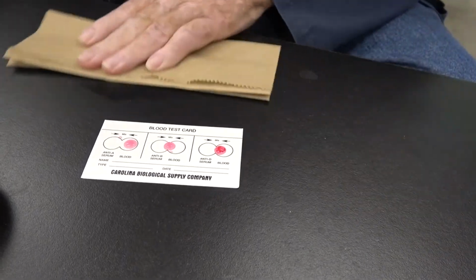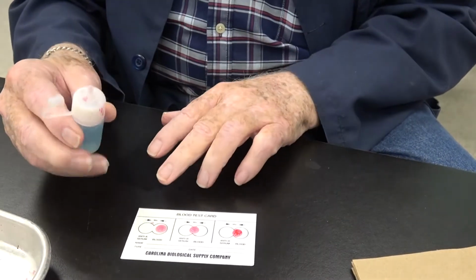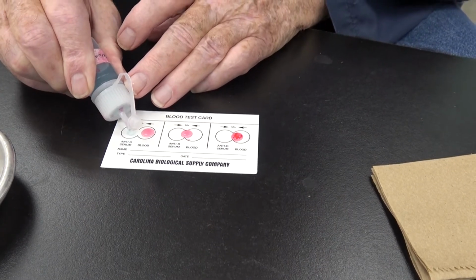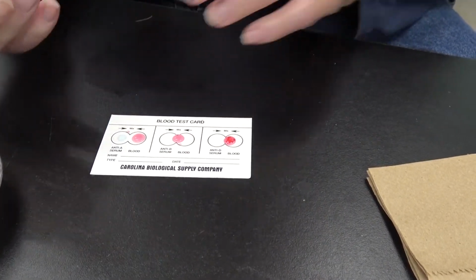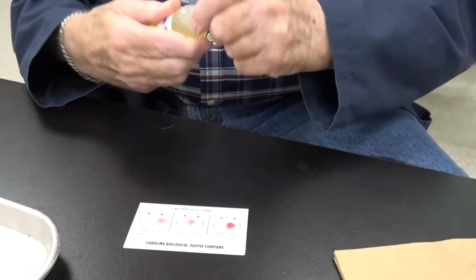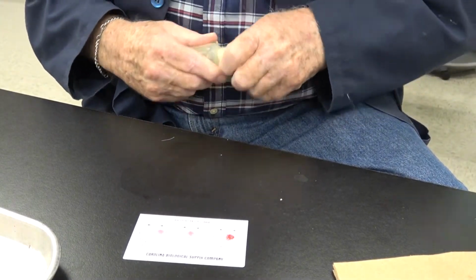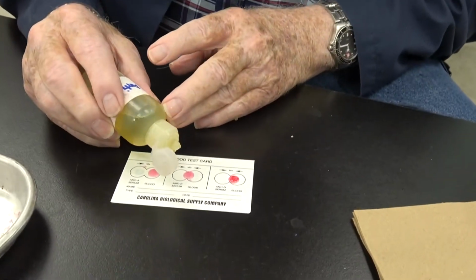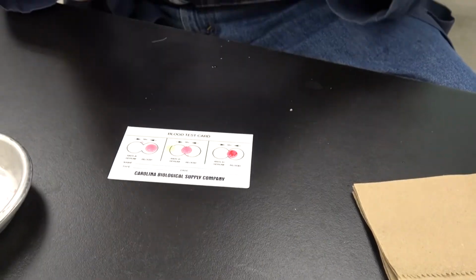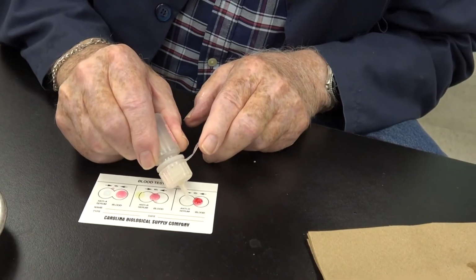And we take the anti-A serum, which was the blue one, and we put it right beside that drop, 1 drop. And then we take the anti-B serum, and drop it right beside it. Then we take the anti-D serum, which is really an RH factor. Drop it here.